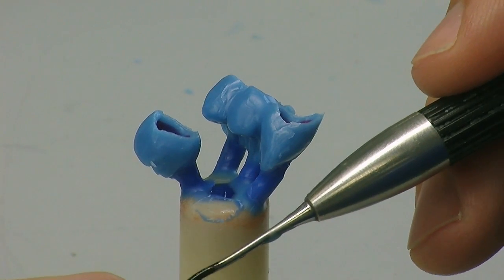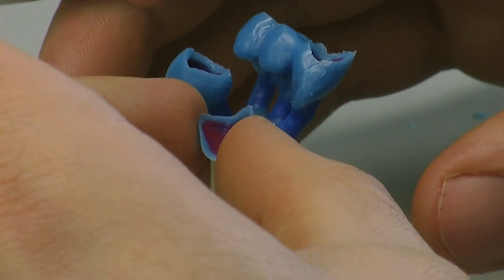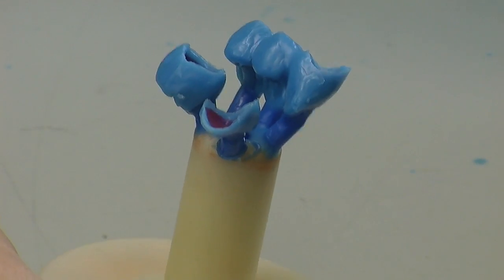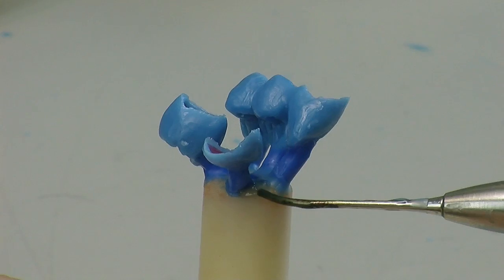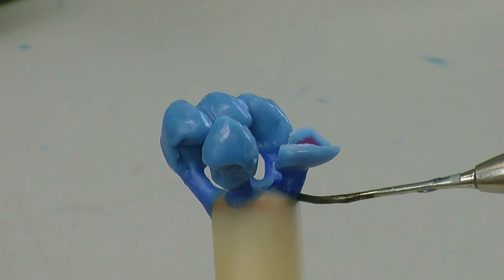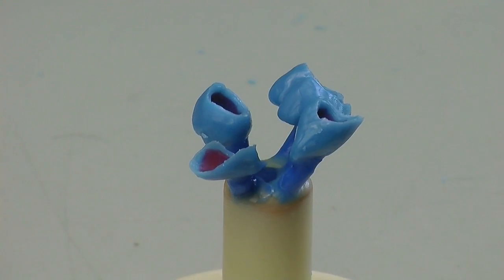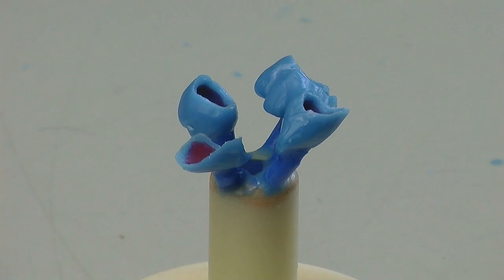Now we're coming to the part where we're actually placing the waxed unit on the sprue onto the former. It's really important that all the sprued wax units are nicely evenly spaced, not too close together. Keep the angle nice and shallow, not too steep, keep the sprues short. As you can see, it looks quite neat. Again, these are just the channels now that the press material, Emax in this situation, is going to flow down and actually press our final job. So that's it all ready now for our pressing procedure.